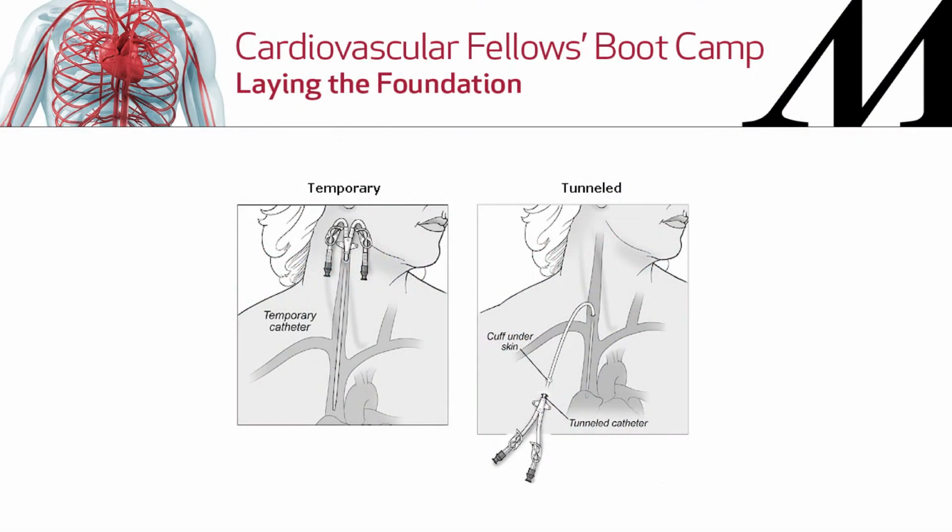So this is an important little point to make. A temporary catheter looks like this, and a tunnel catheter looks like that. Many medical students will describe a patient as having a subclavian tunnel catheter, just simply because the exit point is outside the anterior wall of the chest. And all you have to do is palpate that catheter and its course, and you can see that they both enter the IJ vein. So this is a mistake not to be made by a vascular surgeon.